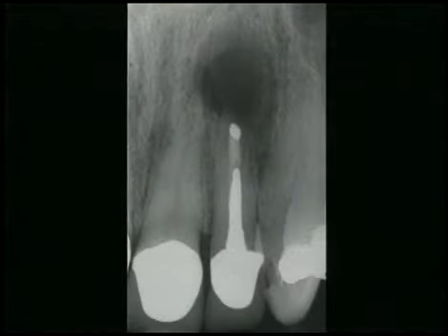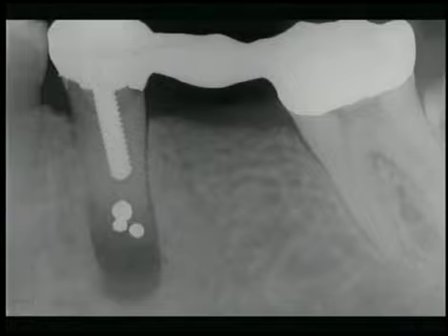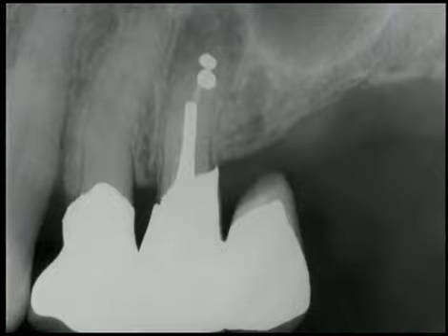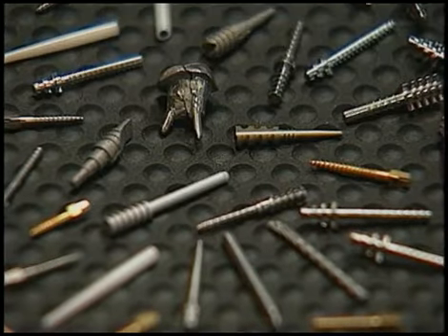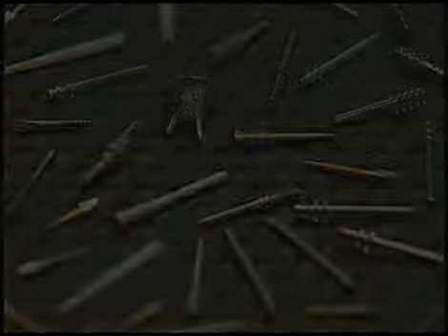Endodontic surgery is still too often selected to resolve failures. Surgery is limited in its ability to predictably eliminate pulp, bacteria, and related irritants from the root canal. In endodontic retreatment, you will encounter posts placed 10, 15, and 20 years ago. Therefore, clinicians need to familiarize themselves with a variety of post systems and configurations.